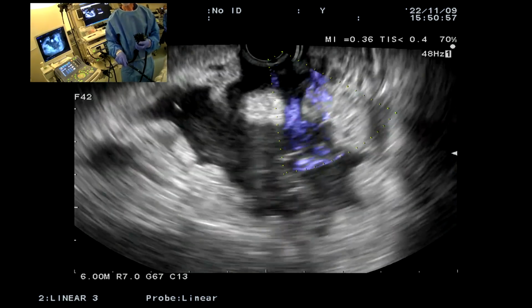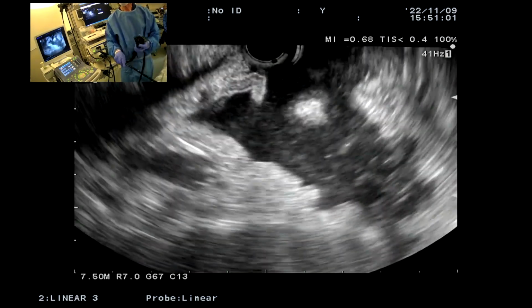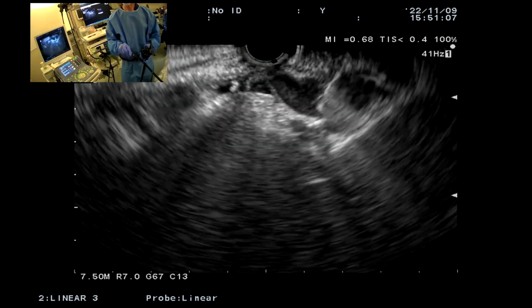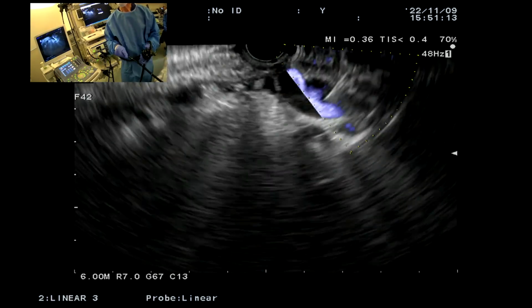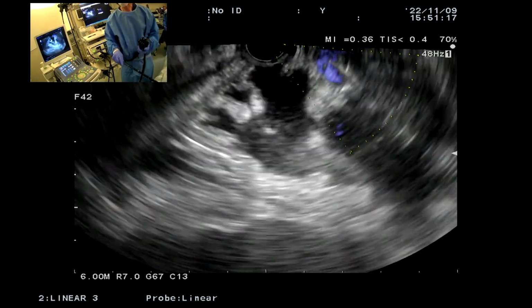obliterated. So we'll take the Doppler off again for a moment. So this is the fundus. Now, these are the collaterals outside, and this is the splenic hilum. And of course, here there will be some blood flow. All right, so that's the hilum. We don't want that to be occluded.